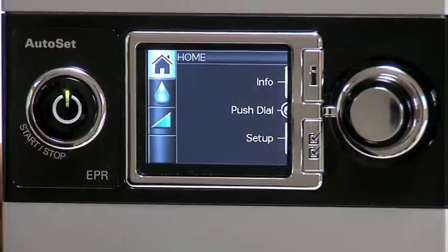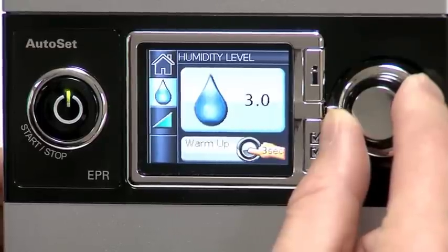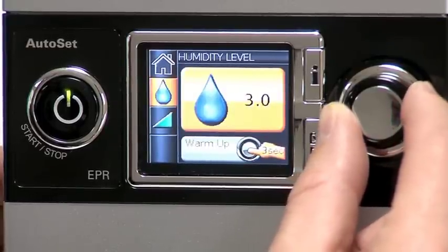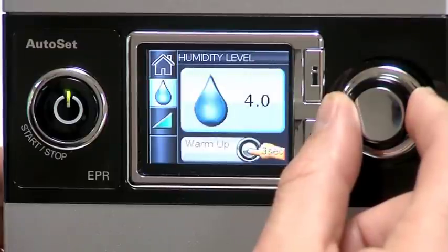To adjust the level of humidity, begin with your home screen and turn the push dial until the humidity level screen is displayed in blue. Then press the push dial to select that option. Now turn the push dial again until the humidity level you desire is displayed. Then press the dial to confirm your choice.